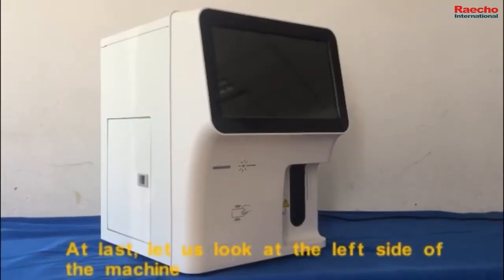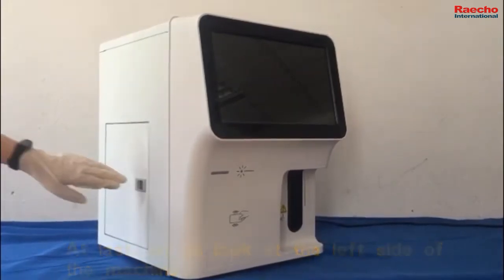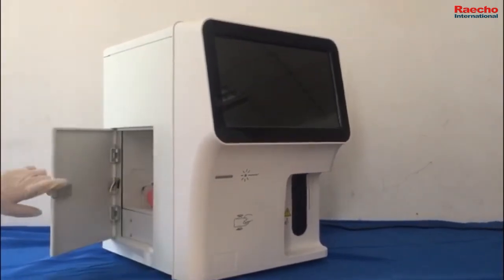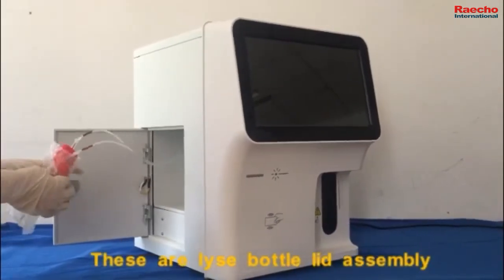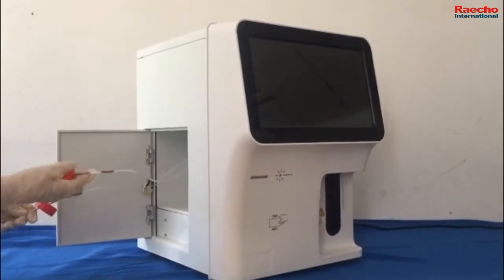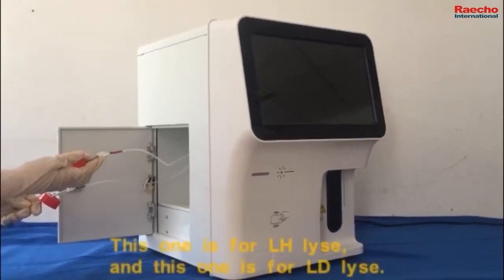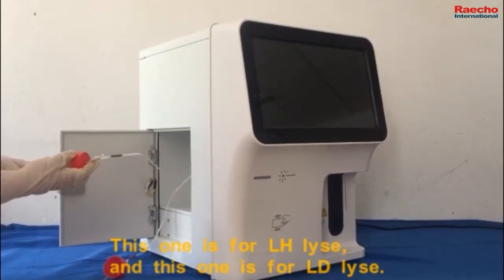At last, let us look at the left side of the machine. These are the lyse bottle cap assemblies — one for each lyse reagent type.